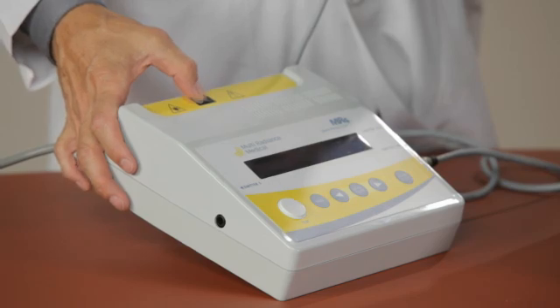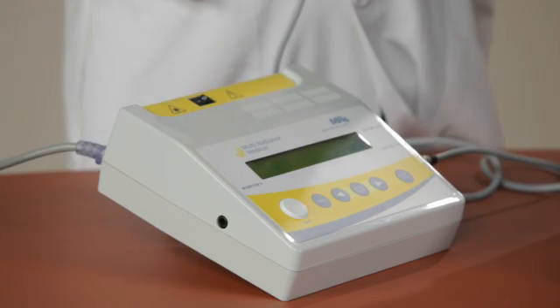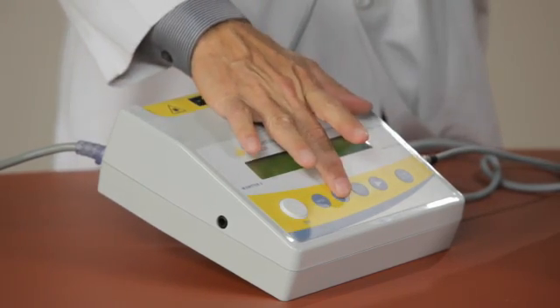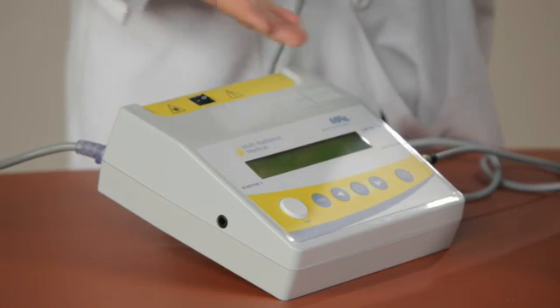Today we're going to discuss the MR4 laser stem and how the application should work. On the unit itself, simply turn the unit on. We will move through the self-test and pick the program that we would like on this particular individual depending on the condition.